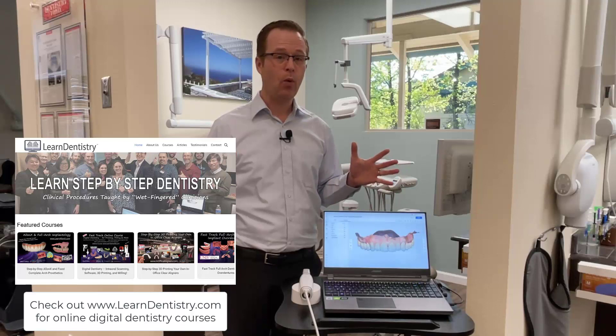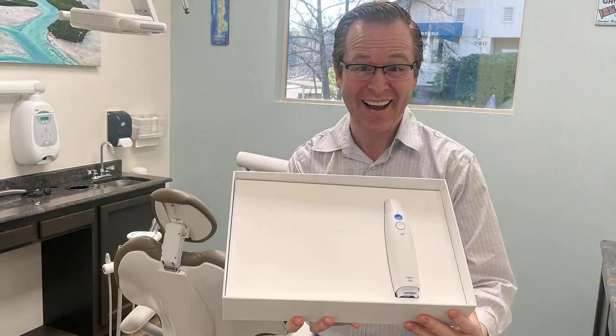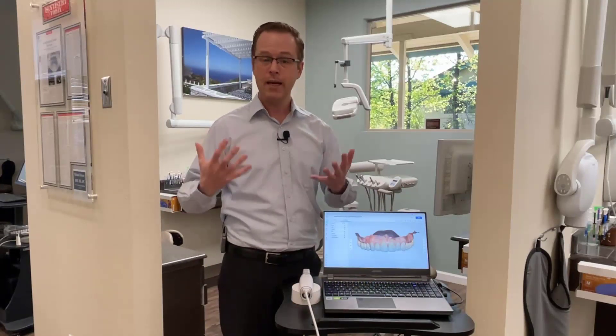I'm coming to you today because I wanted to share some of my initial first thoughts about the new and exciting Medit i700 intraoral scanner. I'm pretty excited about this scanner because there's a lot of really cool things about the Medit i500 that the entire Medit team has been really innovating with for the past couple years. Now that the i500 has been in the market for some time, team Medit has gotten a lot of feedback from clinicians about what to improve to make it even better.